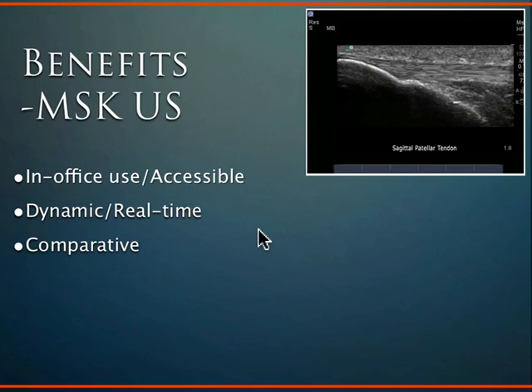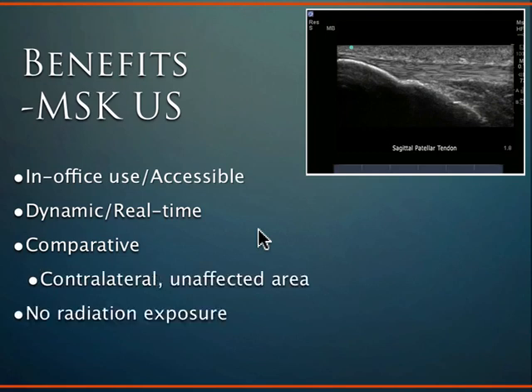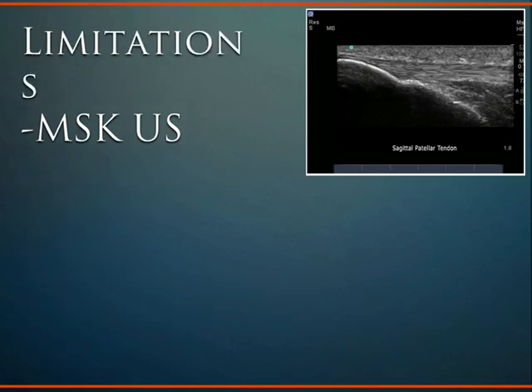And that's real time. You can't do that with an MRI. You can't do that with x-rays. It's comparative. It's in the office. It's cheap. It's safe. And there's no radiation exposure. So a lot of benefits to this modality and having it in the office.